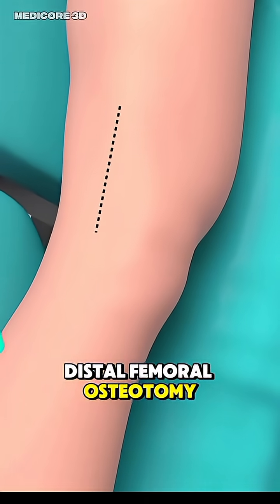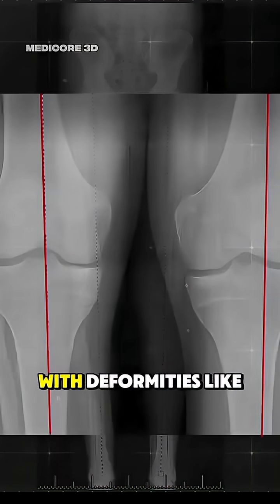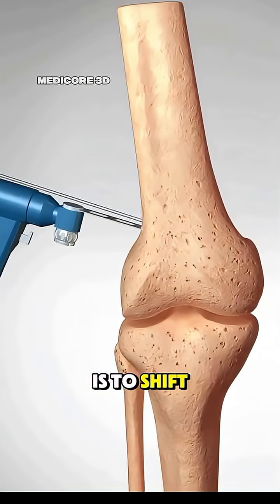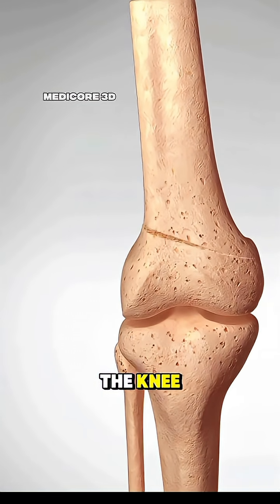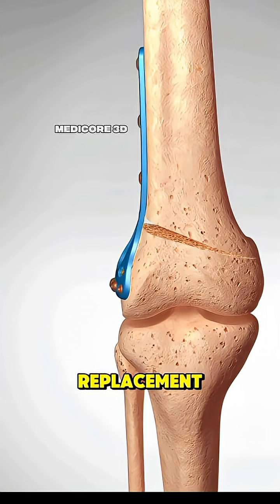Distal femoral osteotomy is a surgery done to correct knee alignment, especially in people with deformities like knock knees. The goal is to shift weight off the damaged part of the knee to reduce pain and delay the need for knee replacement.